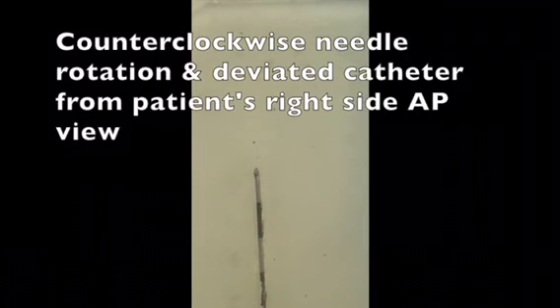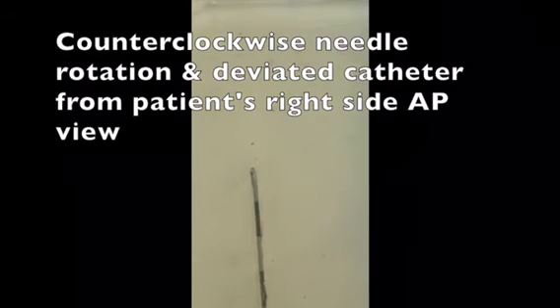then I will take the catheter back into the needle and rotate the needle counterclockwise a few degrees, and then re-advance the catheter, asking the patient again, where do you feel the pressure? The patient will say, I still feel it on the right side, but it's more toward the midline.